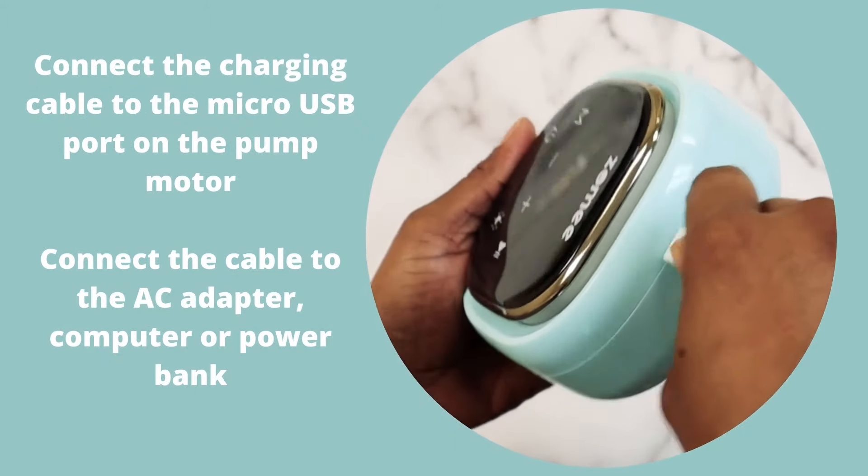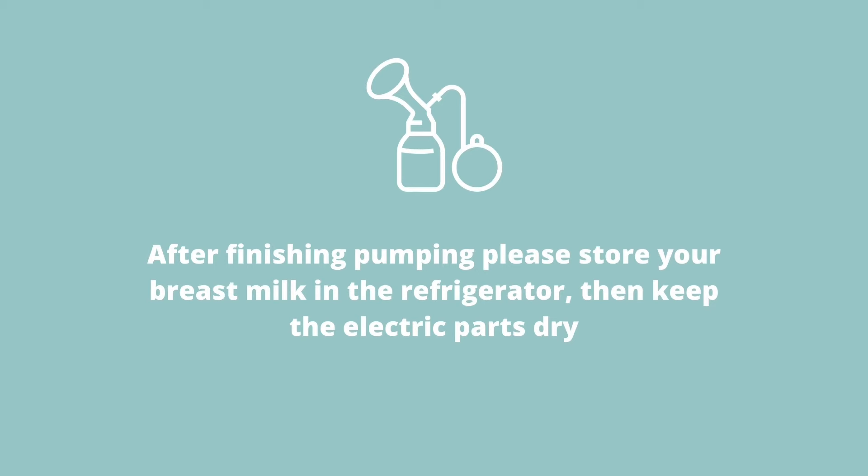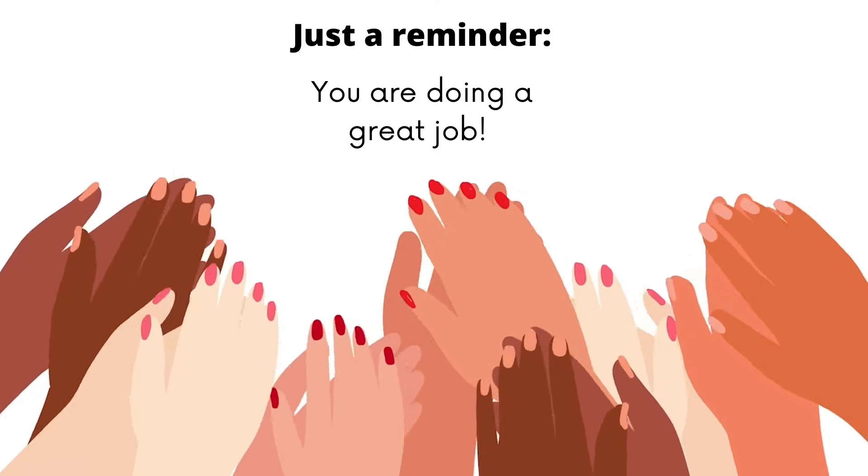Connect the charging cable to the micro USB. After finishing pumping, please store your breast milk in the refrigerator, then keep the electric parts dry. Just a reminder — you're doing a great job.